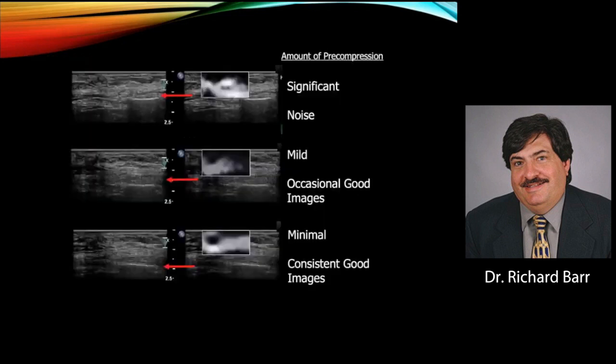And this is an example of, again, the red arrow is pointing to a rib. And you'll notice in the top images, it's about 12 millimeters. It's about 16 millimeters in the middle one, and almost 2 centimeters in the bottom one. And there's a little epidermoid cyst that you don't see very well. But if you look, when I applied a lot of compression, we don't see anything.